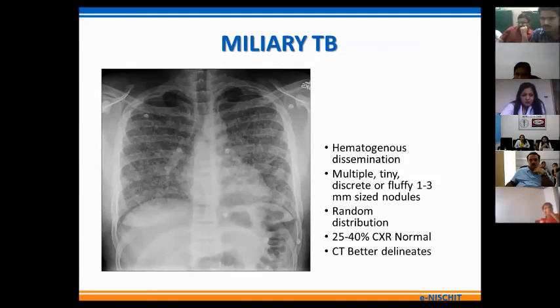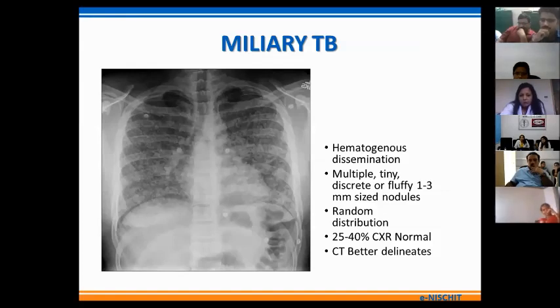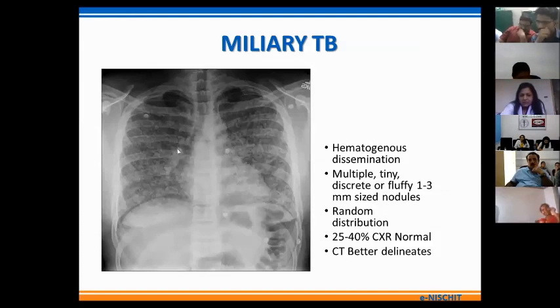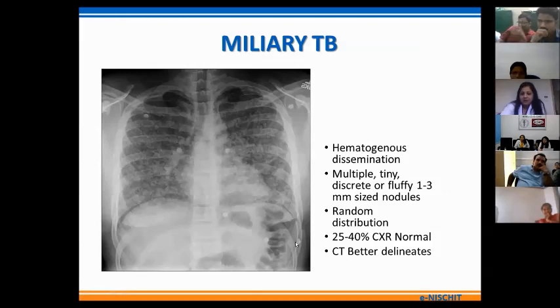Miliary TB occurs due to the hematogenous dissemination of infection and the X-ray findings are very classical. It consists of multiple tiny discrete or fluffy nodular opacities spread randomly across both lung fields, showing a more or less uniform pattern of distribution. The nodules are generally in the range of 1 to 3 millimeters. In approximately 25–40% of miliary TB patients, the chest X-ray can also be normal, and CT is a better modality to pick up miliary nodulation.